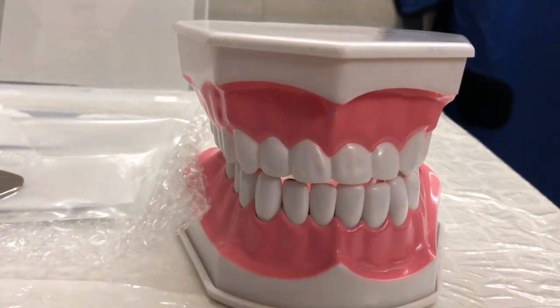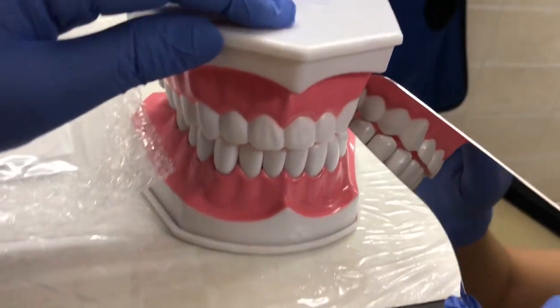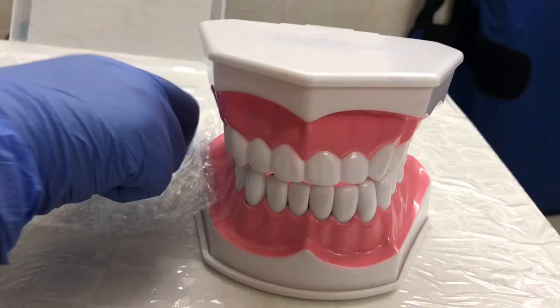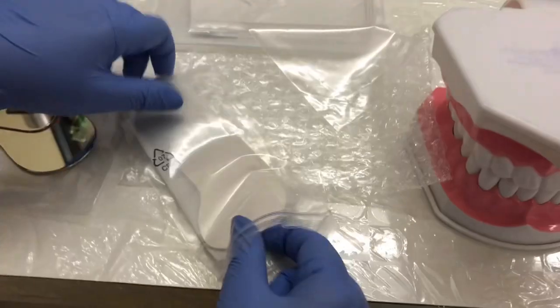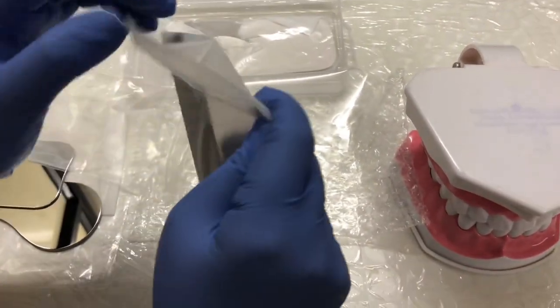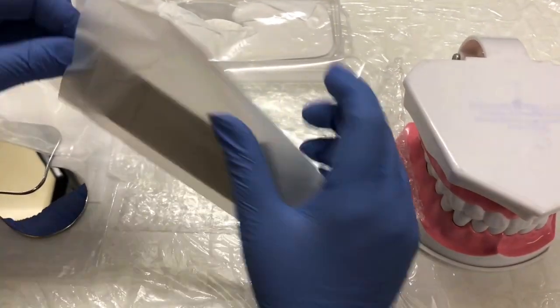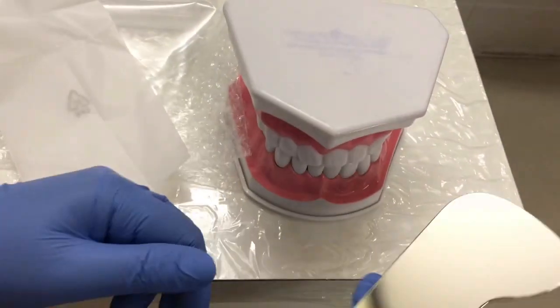Then next comes your buccal mirror. This is multipurpose — buccal and lingual for both.